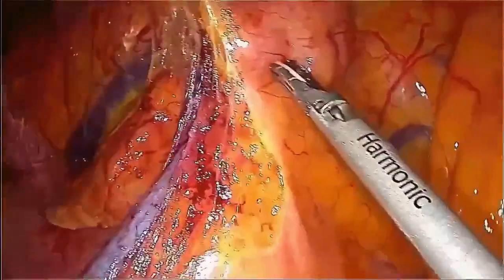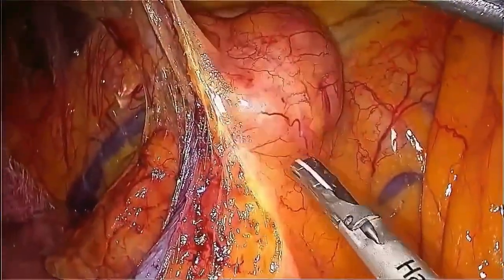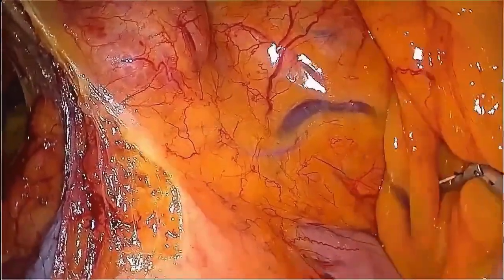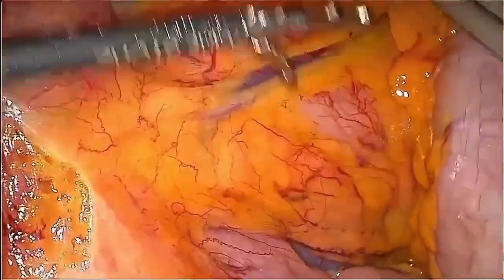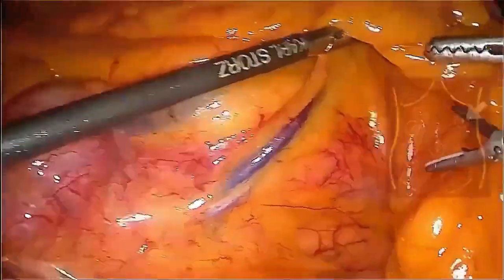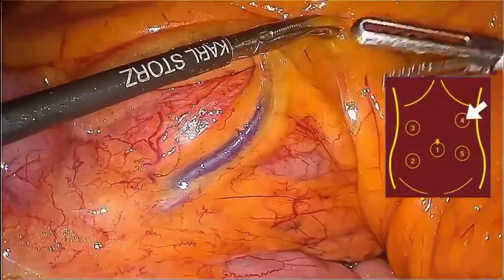To approach the middle colic vessels safely, we need to initially access the omental bursa by an incision in the transverse mesocolon. A good exposure is obtained by a P4 traction close to the left branch of the middle colic.